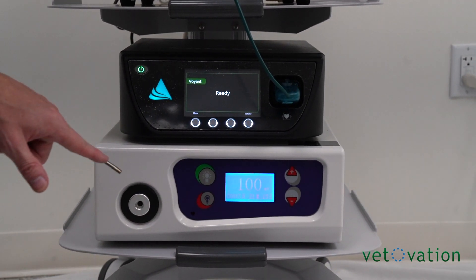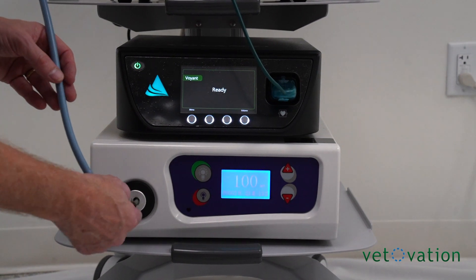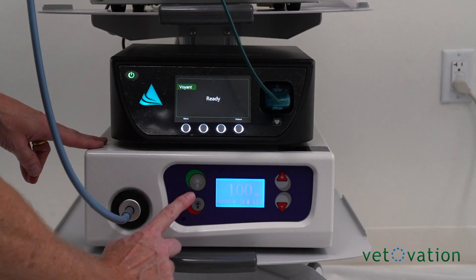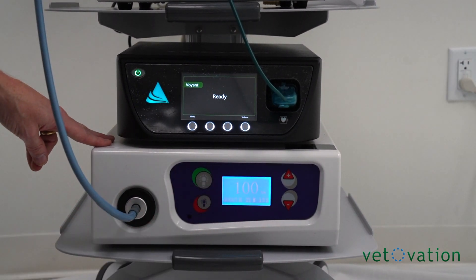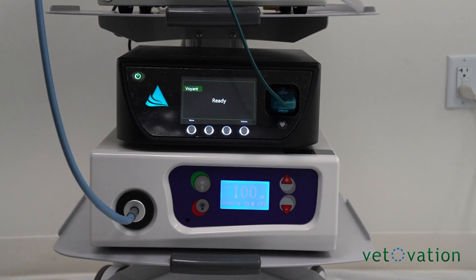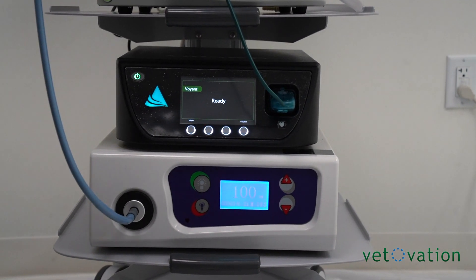The doctor will pass off the male end of the light cable. Plug it directly into the light source — you'll feel it click a little bit as it goes in. When they're ready, hit the green button to turn it on. It's an extremely bright light, so make sure you turn the light off when they're not using it at the end of the case.